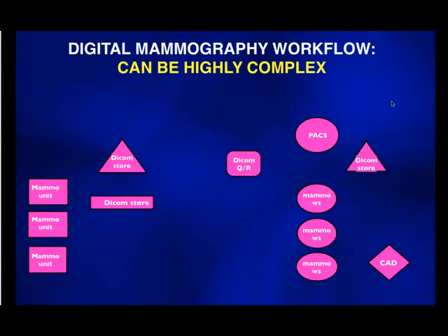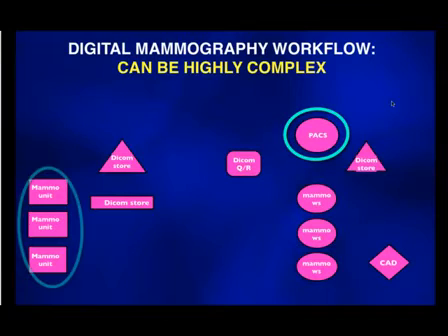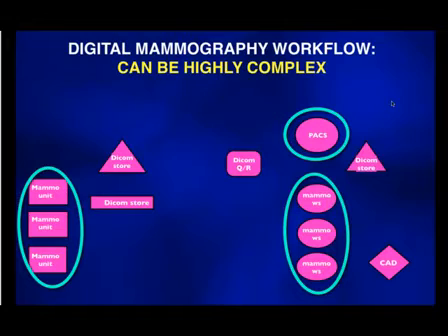We must have a good electronic workflow system involving PACS and involving RIS. And speaking of which, we're going to get the next slide here. The PACS system is really the heart of any good, efficient system in any hospital now and any clinic. And if you have a small PACS system and a small department, it's not a problem. But the truth is, as we grow, we are not dealing with just one mammo unit. We are dealing with several mammo units, which must all be connected to the PACS system. And indeed, most departments have several workstations, which again present a much more complex communication problem for our overall department.